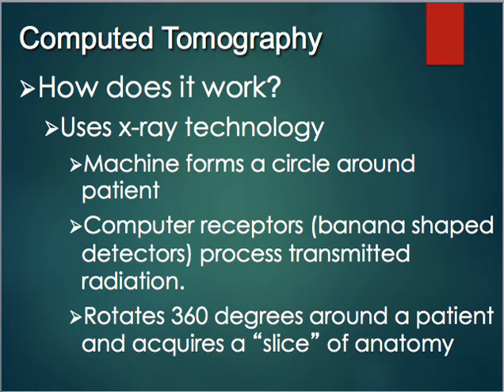So then after all of those slices are obtained, everything's reconstructed by the computer into a two-dimensional image of that slice that was scanned.